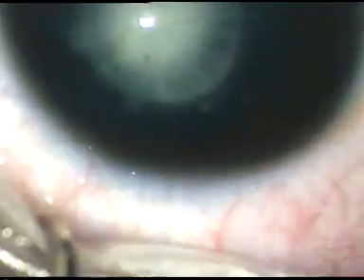Dear colleagues, this is congenital lenticular cataract in a 10-year-old girl. I have taken up this case for surgery. Let us see how it was done.